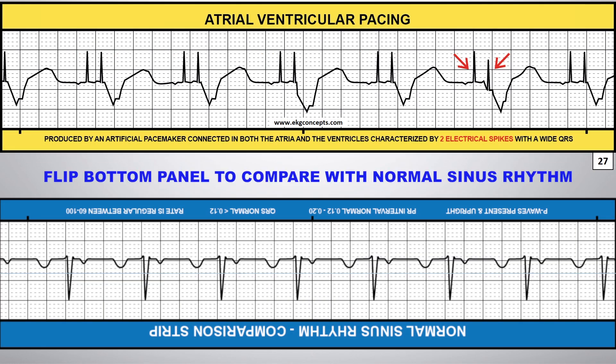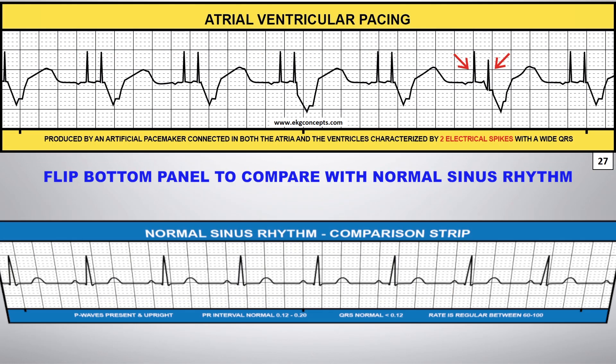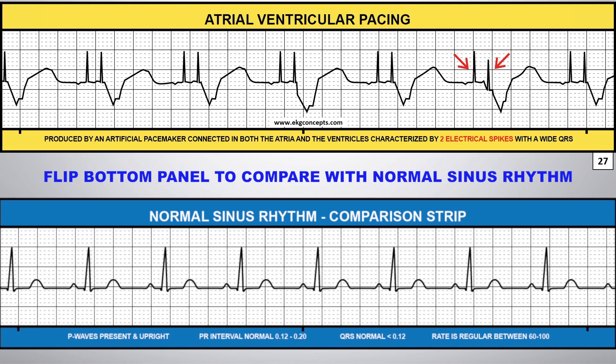You can flip the comparison strip on the bottom panel to compare this rhythm to normal sinus rhythm. So, let's take a look.